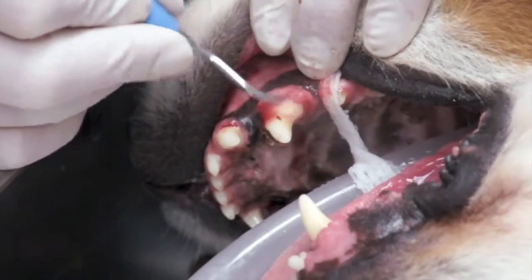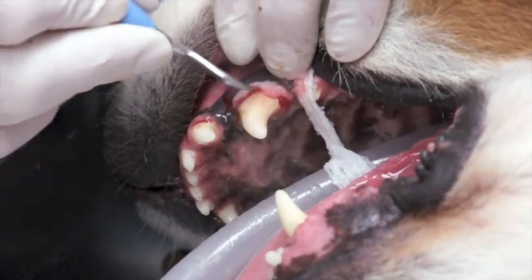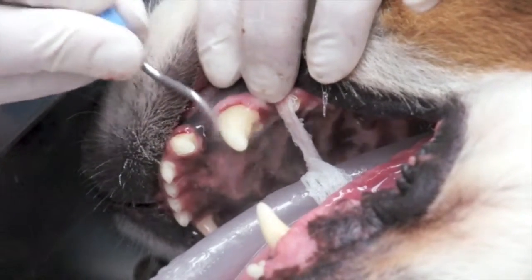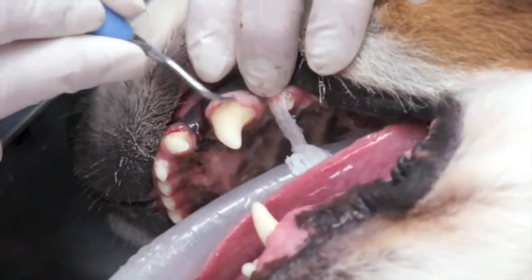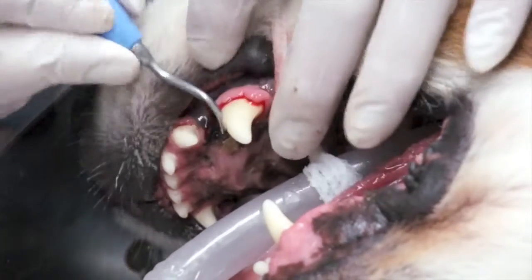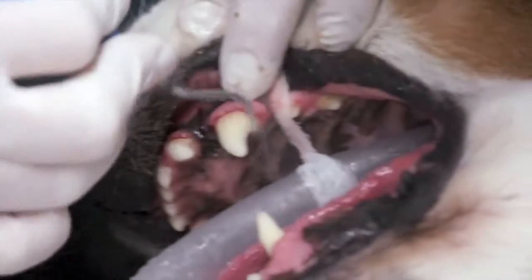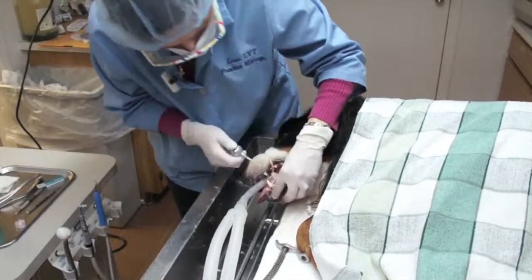In some cases with older animals, you may not be able to get their teeth as white as you would like. What ends up happening at that point is what we call staining has occurred. So no matter what you try to do, you will never end up getting that tooth completely clean. What we're going to do now is rinse.